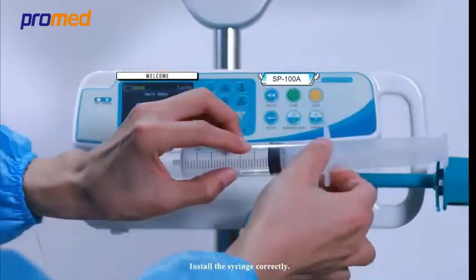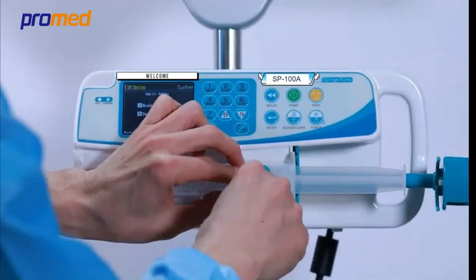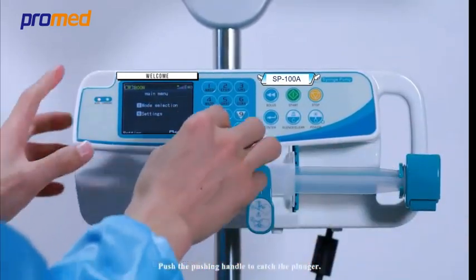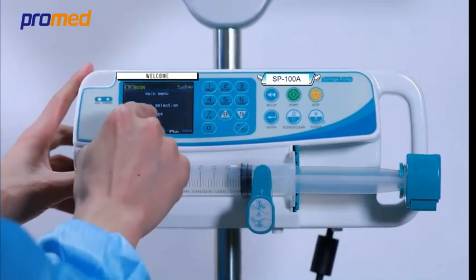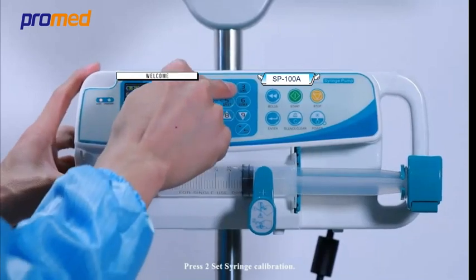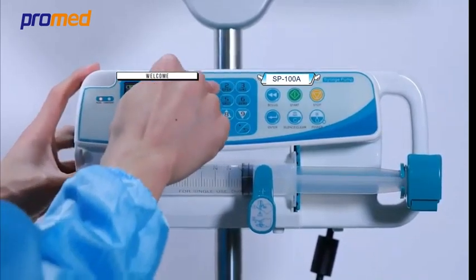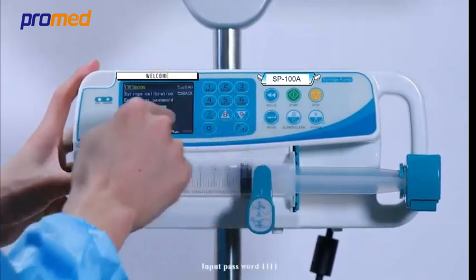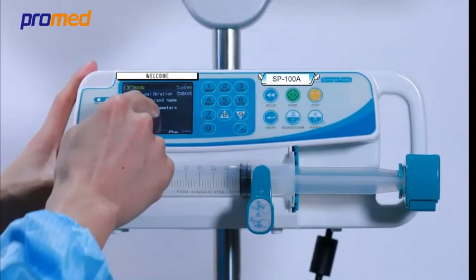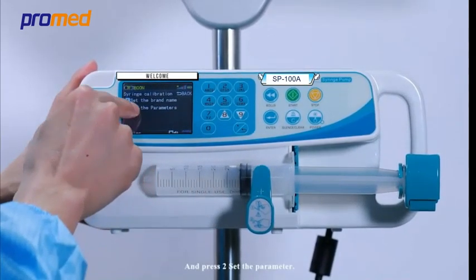Install the syringe correctly and push the pushing handle to catch the plunger. Enter into the setting, press 2 to set syringe calibration, input password 1 1 1 1, and press 2 to set the parameter.